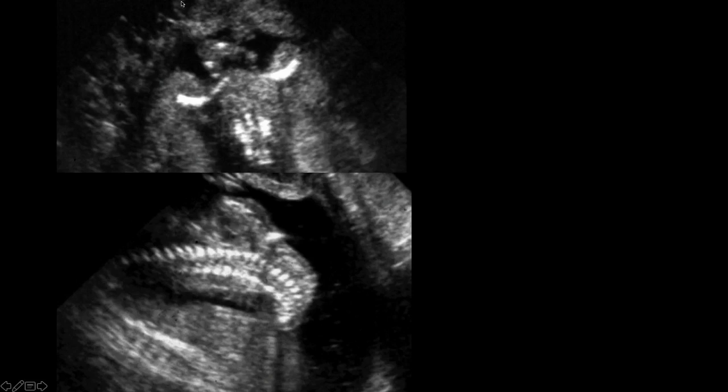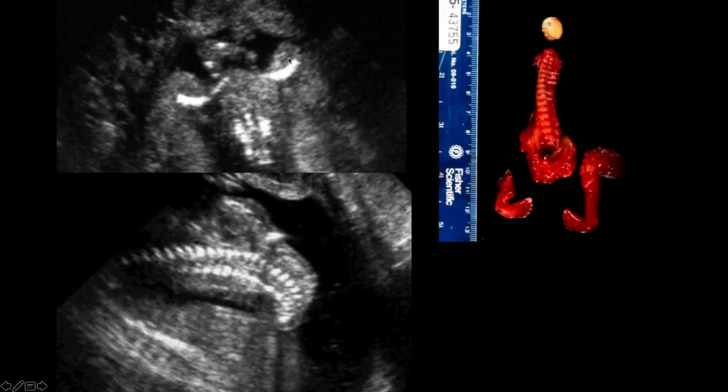It was for an elevated AFP, I remember that. It was a while ago. And this is what was going on. First of all, the fetus had club feet, I'll give you that. But there was nothing above the cervical spine. The cervical spine ended. The clavicles were here. The fetus was alive, moving around like crazy, but there was no head.